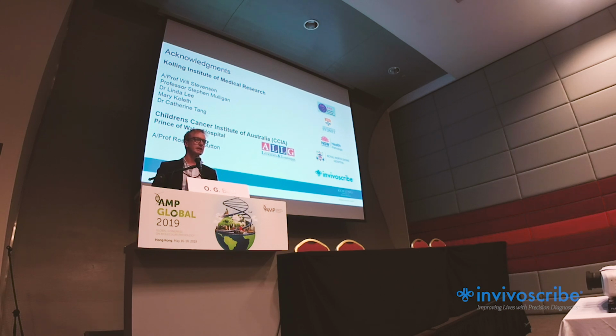Yeah, no, we haven't done that yet. As I say, that MRD quantification is at a very early stage at the moment. The LymphoQuant control comes as a cells equivalent. So we spiked in 100 cells equivalent, so that's how we generated the MRD level. But we are talking about having a sequence, a plasmid that we can spike in and measure that. But obviously these samples are quite precious, and so we're a bit limited by that. But yeah, that's something we will be doing.